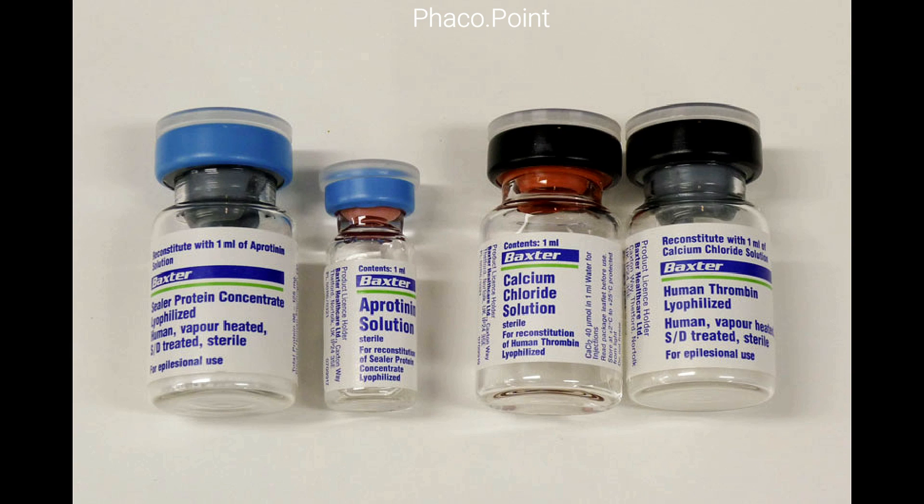The larger blue bottle with the blue stopper contains the freeze-dried sealer protein concentrate, which is largely human fibrinogen. The smaller blue bottle labelled aprotinin contains the synthetic fibrinolysis inhibitor. The larger bottle with the black stopper contains human thrombin, and the second slightly smaller black bottle contains the calcium chloride solution.